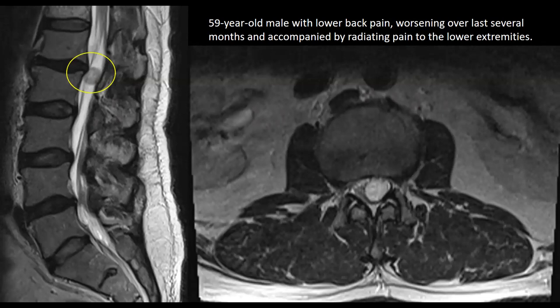Just for those who are unfamiliar with imaging, you can see where the lesion is and what's going on. Anyone who wants to unmute and describe what we're seeing here on sagittal and axial sequences? How about one of our radiologists, neuroradiologists, or non-neuroradiologists? Yeah, there's a rounded intradural mass at the L1-2 level. It looks like it's intradural but extramedullary. It's towards the left side, and the nerve roots of the cauda equina are being pushed towards the right. Yeah, that's perfect. Absolutely.